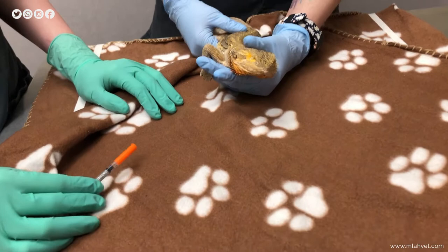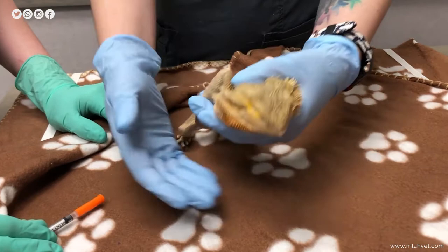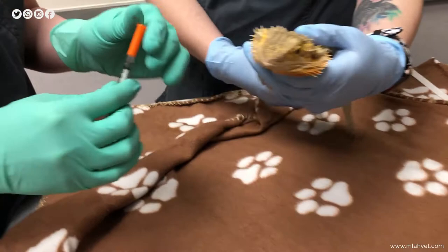Hi, my name is Stephanie and today I'm going to be showing you how to give an intramuscular injection to your reptile. In this instance we have Drogon, who is our hospital bearded dragon, and he's going to be our lovely volunteer to help with this injection.